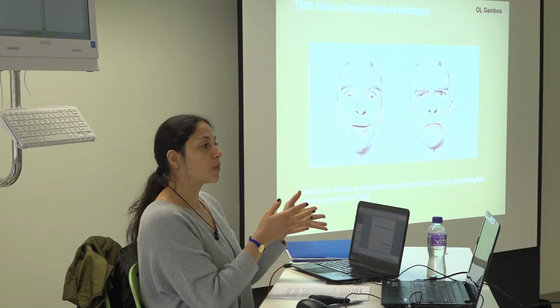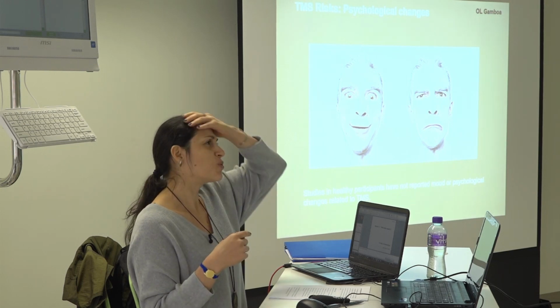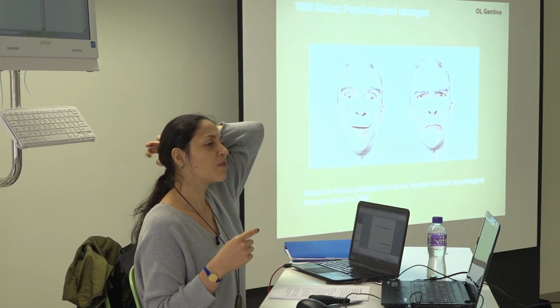This is for the patient population. But in healthy participants, there have not been reported mood or psychological changes due to TMS. So you will not become happier, or more sad, because of TMS. Although I was reading something recent, like 2 or 3 weeks ago, about some type of stimulation therapy that will make you happy. I thought maybe I'm not unhappy, but let's try. Maybe it works.